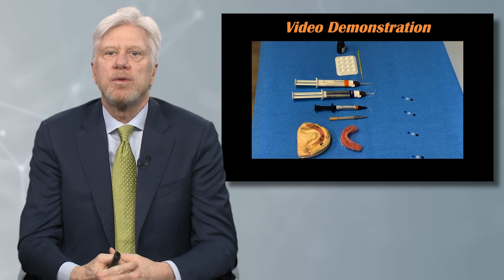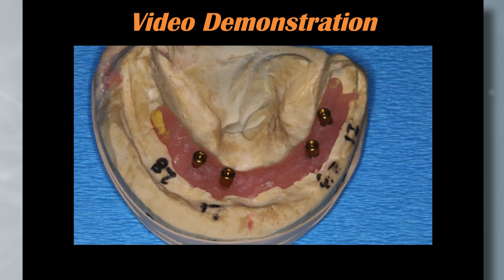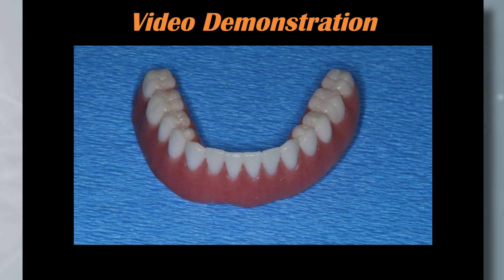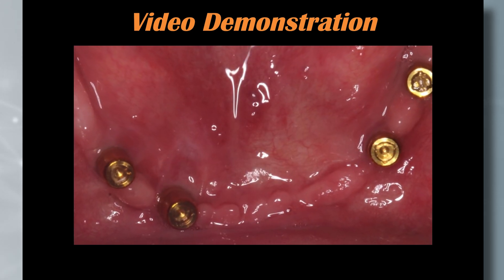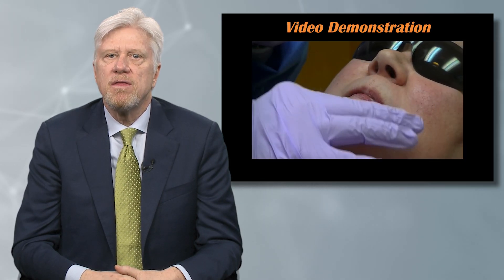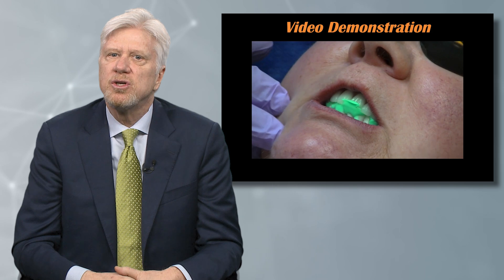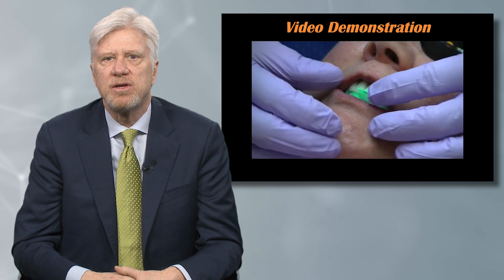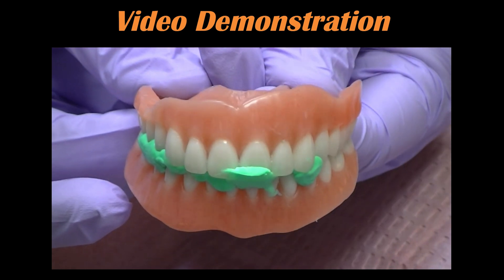We have everything in place — our QuickUp from VOCO, our denture, and our locators in position. We're going to take these off the model and place them in the mouth, torque them into position. I'm doing a bite relation to make sure we are reestablishing correct position. Remember, depending on how hard you press, you could get some soft tissue changes, so simply do a bite relation one arch at a time. You can see we have a nice bite relation and a good relationship.